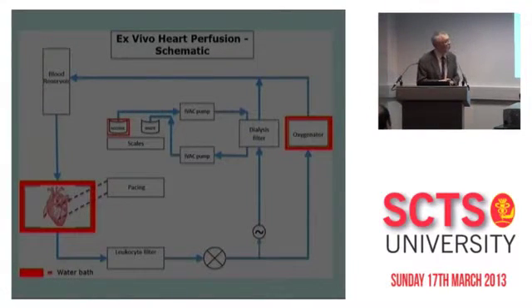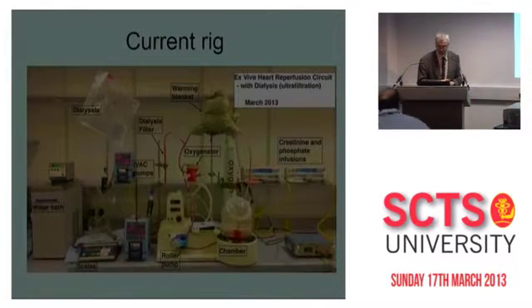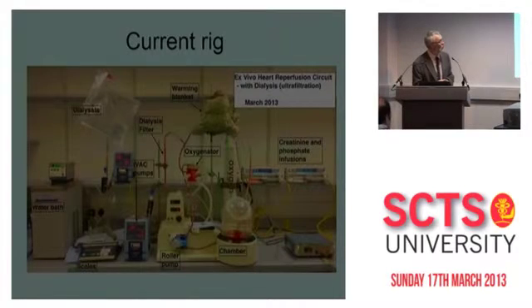Now our circuits actually got a bit better, so that we've put in a paediatric dialysis filter, which is maybe slightly better than the adult dialysis filter that we had in there, and you can reasonably well control the dialysis of the circuit, and you combine that with an oxygenator, but otherwise the system is as it was, and that's what the whole thing looks like.